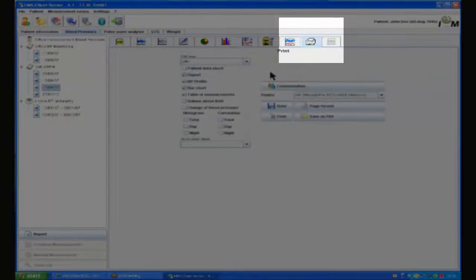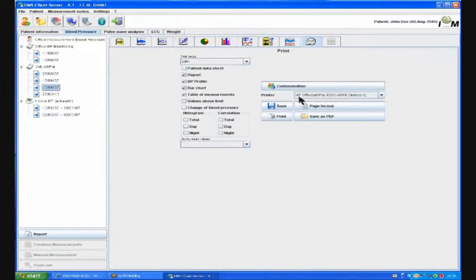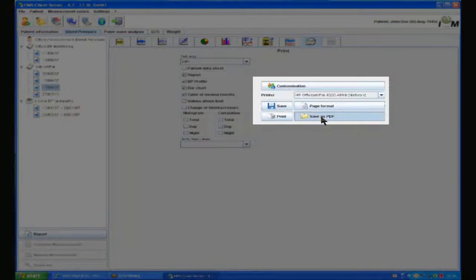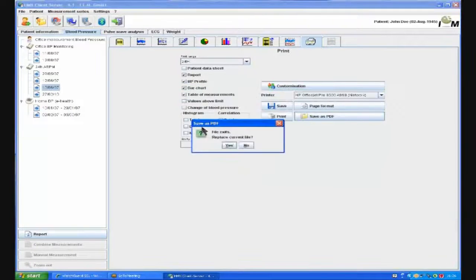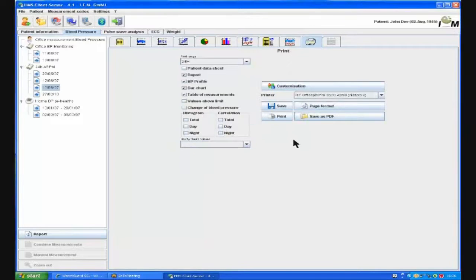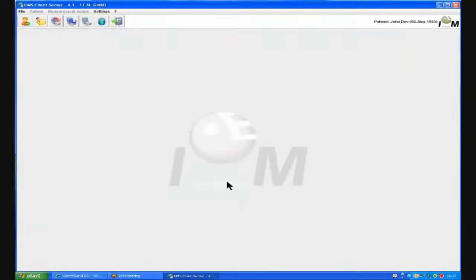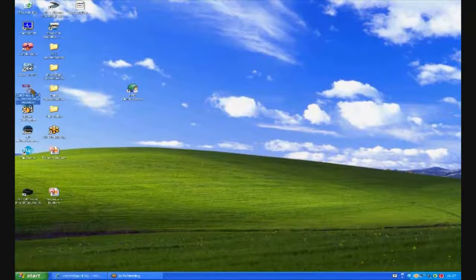To print, we press the print icon. We need to select which page formats we would like printing. We can select to print to our local printer; however, it is better to save as a PDF. When pressing the save PDF button, a save window opens. In this example, we are saving to the desktop for ease. Once saved, we can close the program. We can now view the PDF by going to the location where it was saved. If you would like to attach the PDF into the medical record, simply browse to this location and attach using your particular attach function.